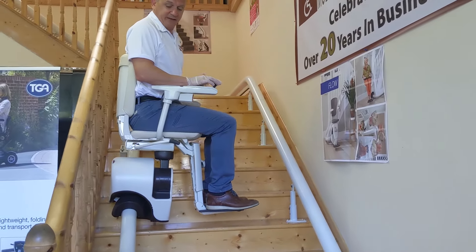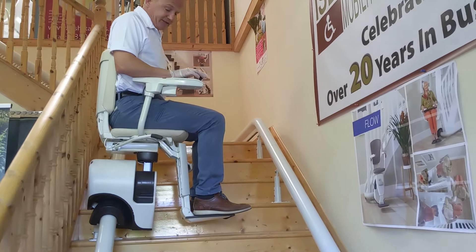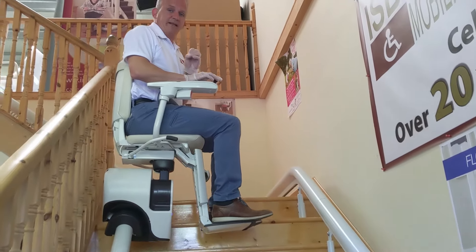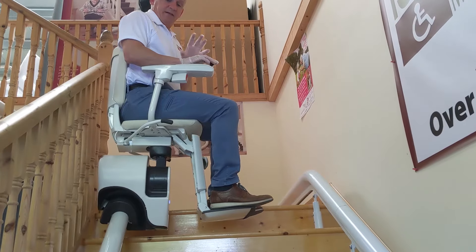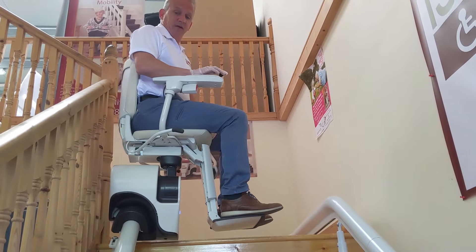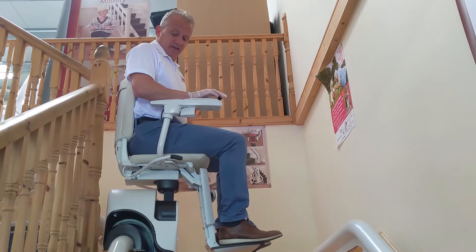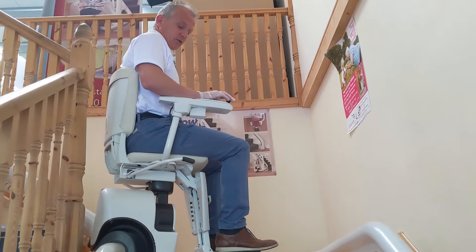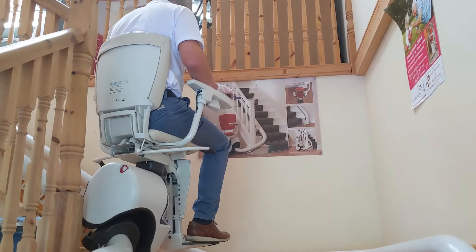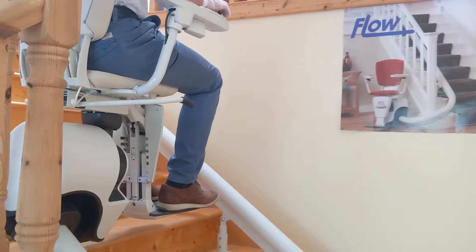The rail is three inches in width and diameter, and as you can see there are legs on different sections of the stairs — that all depends on your staircase. The measuring technology is now done by CAD drawing: we come out, take photographs, and the lift is made to measure for your stairs. We're slowing down again now because of a 90-degree bend coming up, so it slows down and then quickens up again on the straight section.